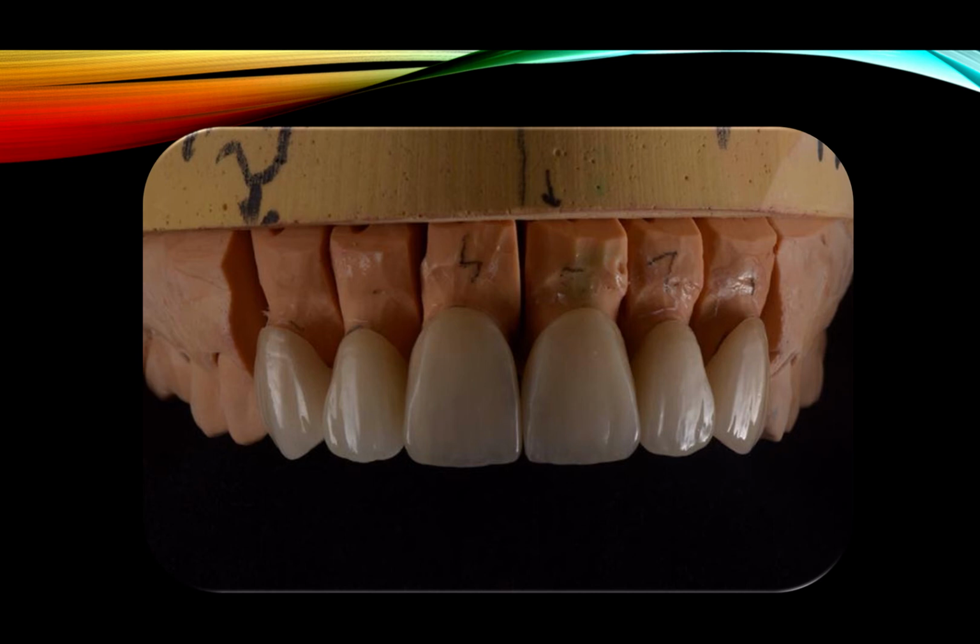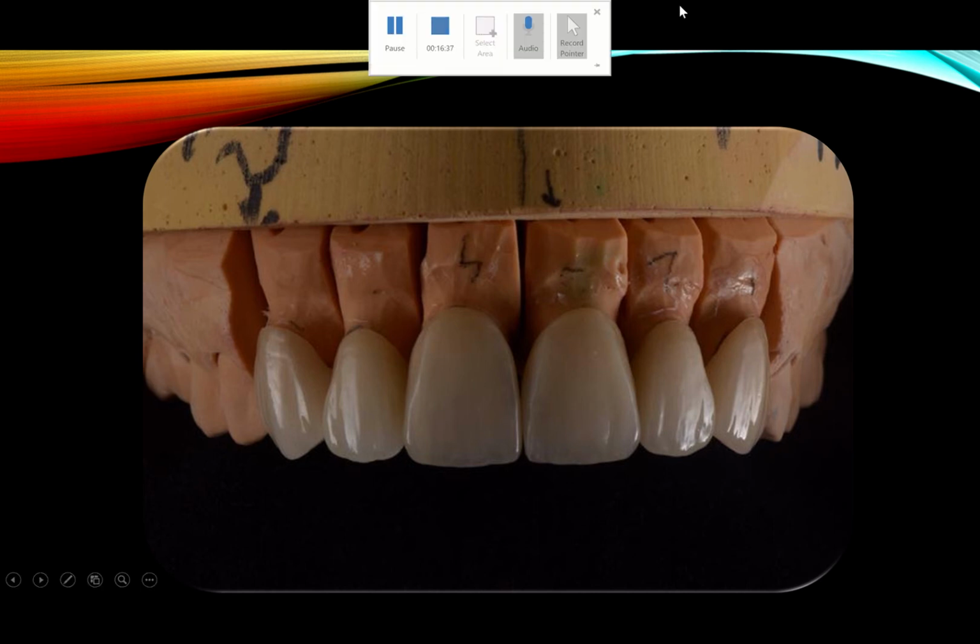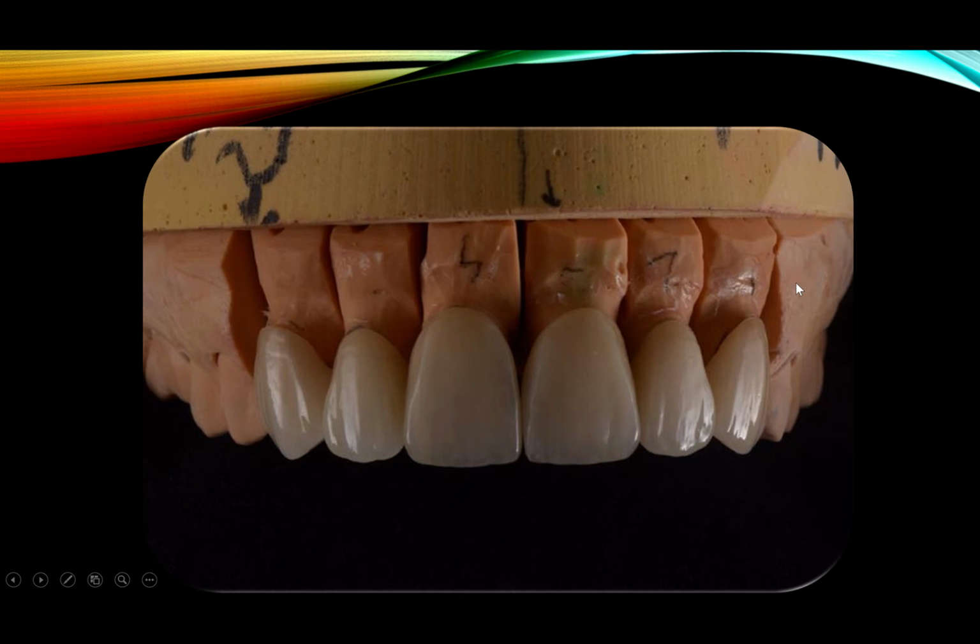And that works on very, very limited spaces. I will show you right now very thin veneers that were micro layered as well. But the thing is, everything gets to me waxed up really well, pressed really well, and then I micro layer. Same thing with zirconia.